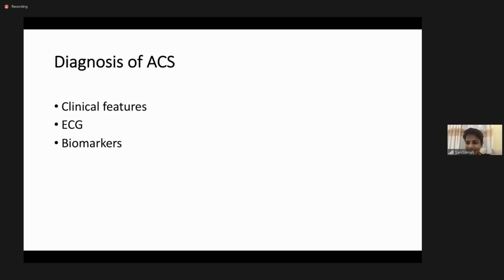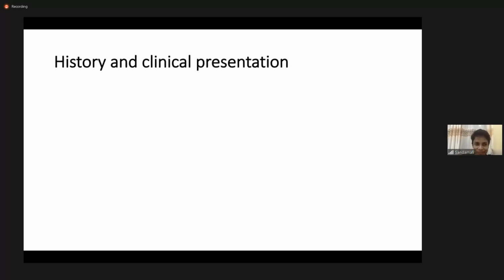Even though my topic is ECG interpretation in ACS, last time I think it was mentioned that diagnosis will be done in this lecture, so I will briefly take you through the diagnosis of acute coronary syndrome. It mainly depends on the clinical features and the investigations like ECG and biomarkers.